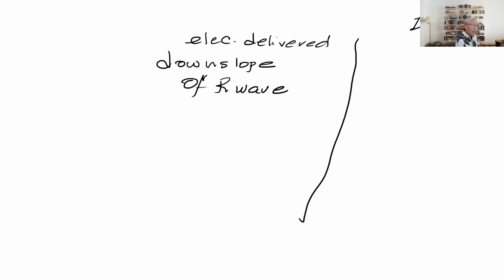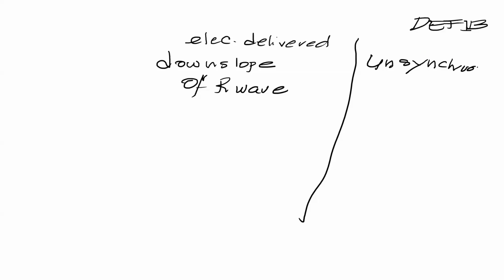Now, in defibrillation, the patient is dead. Does it matter where it touches or where it hits? No. I don't think it matters. So this would be unsynchronized. Synchronized. Finally, right. I understand what synchronized and unsynchronized is. Okay. Finally, so we understand.